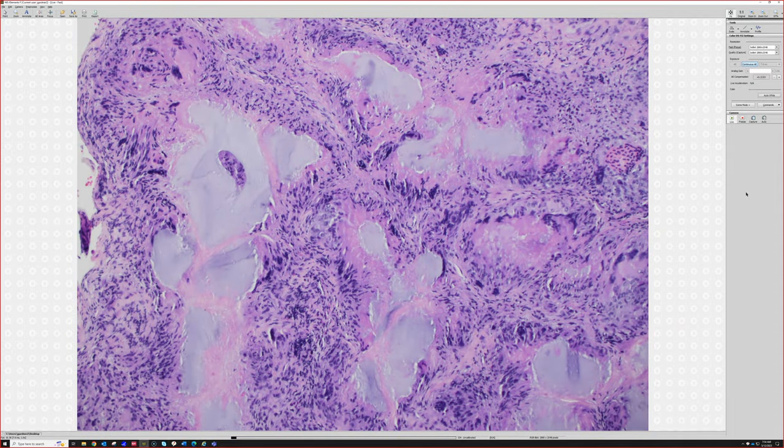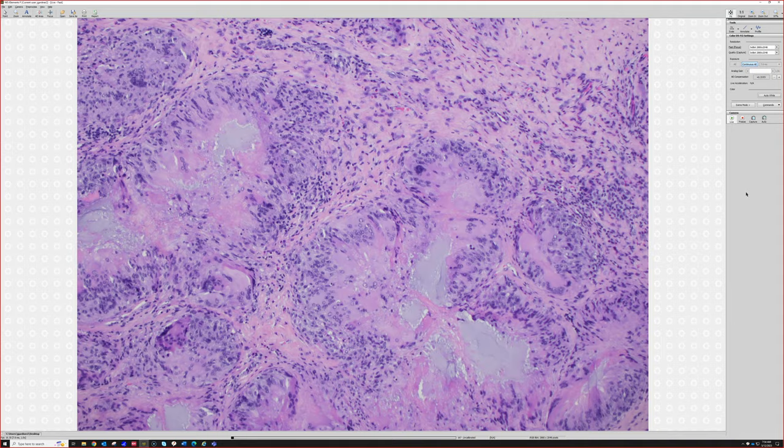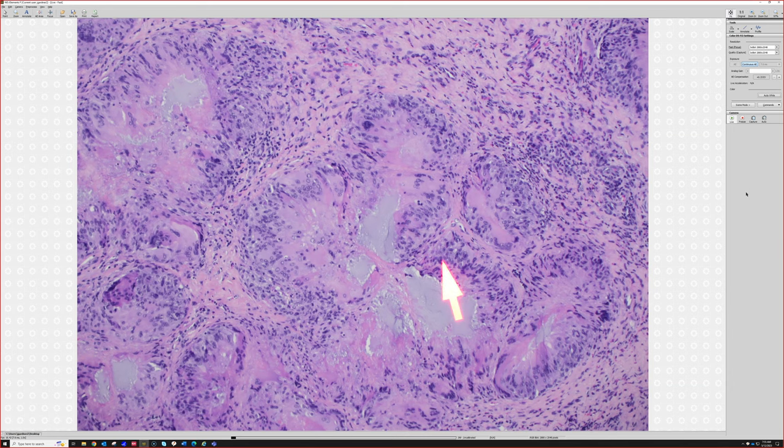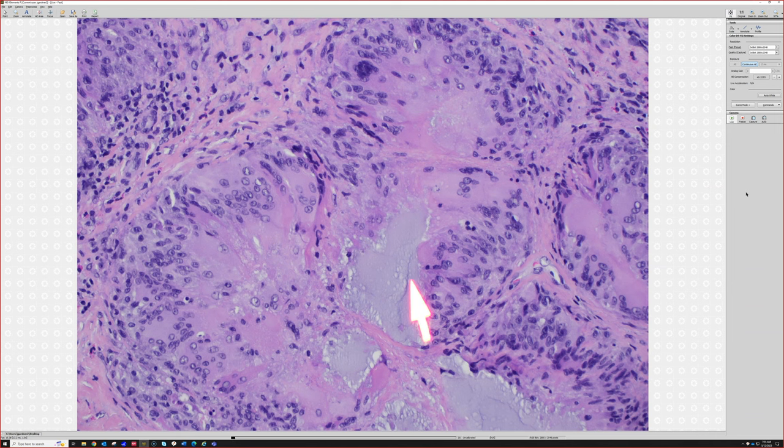That's what's happening. This is an amazing example of what we call palisaded granuloma. That's palisading, right? But this is not one of the palisaded granulomatous disease processes like rheumatoid nodule or anything. But it's the same process, where we've got a bunch of histiocytes, which are epithelioid to spindled, with pale nuclei and abundant, dense, pink cytoplasm, right? And they're lined up around some stuff. And there are some scattered multinucleated giant cells. Look at that huge giant cell, all those nuclei all in one cell.